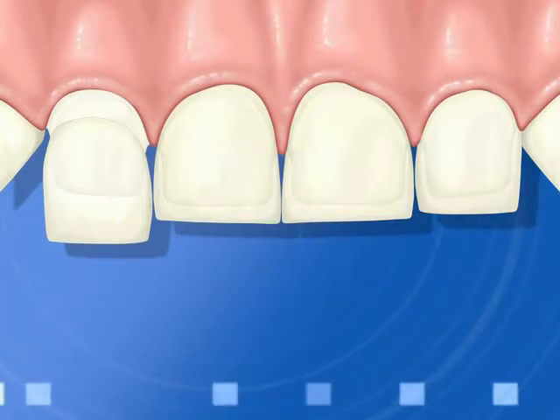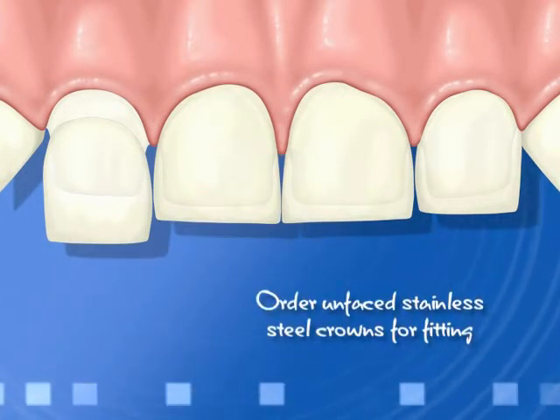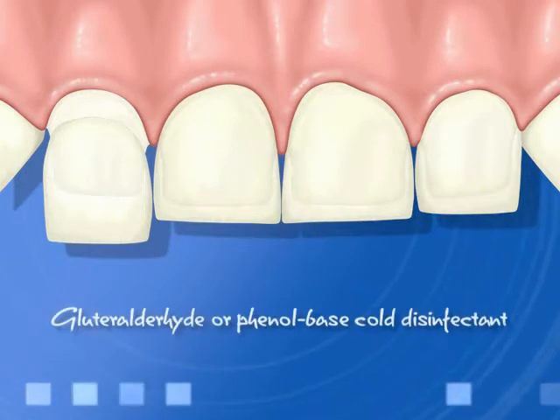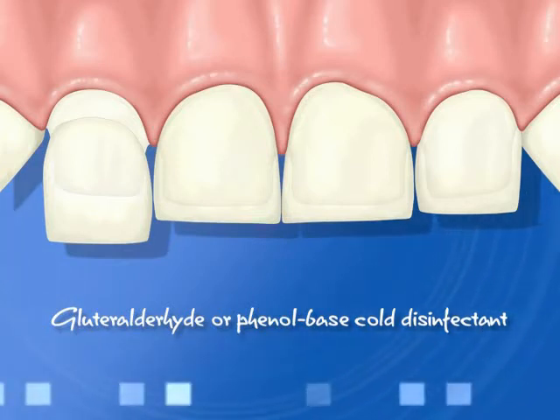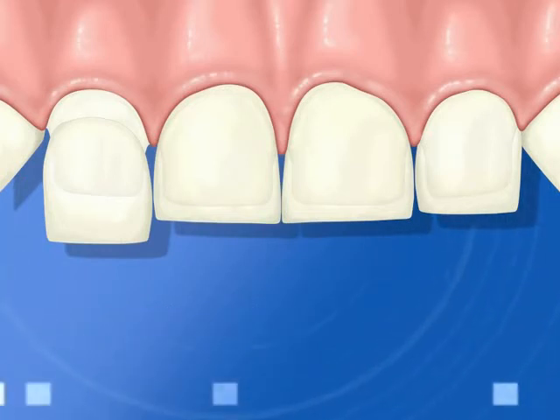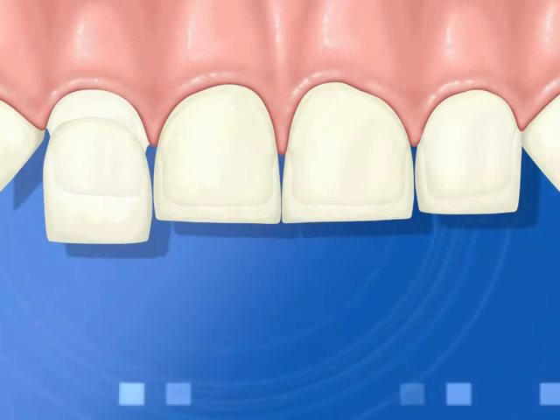You should shape the one you will be using for sizing to approximate the crimp we've made. If you would like to order a set of unfaced stainless steel crowns for fitting, please contact us. We recommend using a cold disinfectant solution, such as glutaraldehyde, or a phenol base to soak the Kinder crowns for disinfecting. We recommend staying away from iodophores or iodine-based disinfectants because of a possible staining effect. Repeated autoclaving may discolor the facing and have potential adverse effects on the bond of the facing.